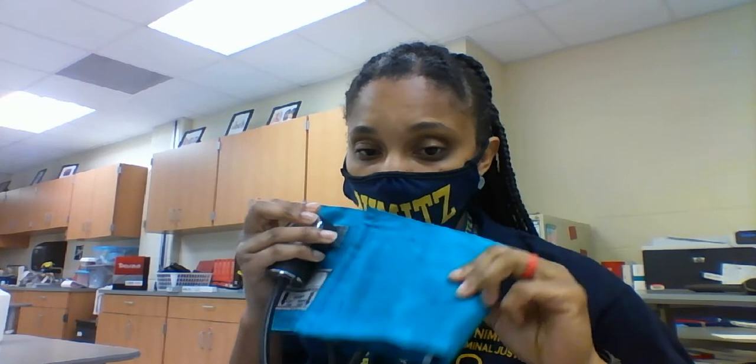So in the PowerPoint, we talked about a sphygmomanometer. That's what this is. It says it on the dial. Can't miss it. This is how you are going to read your blood pressure. Now, if you have a manual cuff at home, it would be good for you to practice based on the instructions that I'm giving. And I will also find a video for you to watch that will show you a two-person interaction as well.